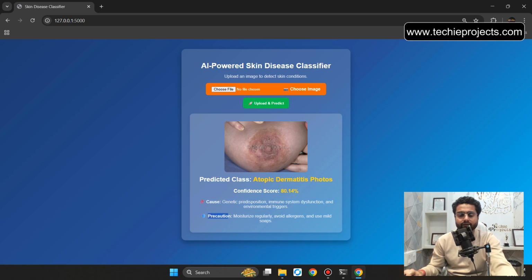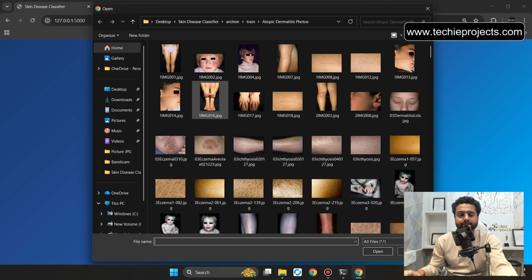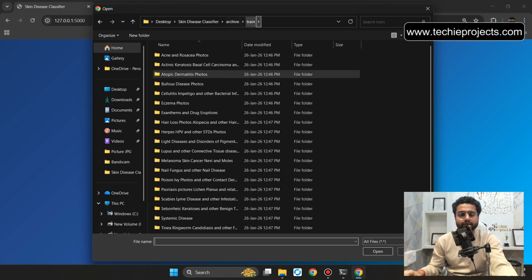And the precaution: moisturize regularly, avoid allergens and use mild soaps. Let's go back. Now select any other file from a different folder.